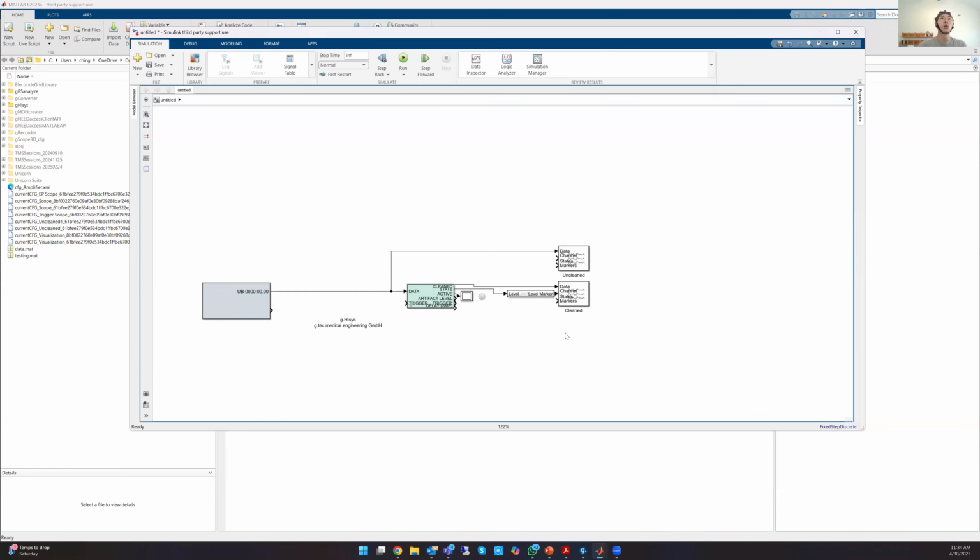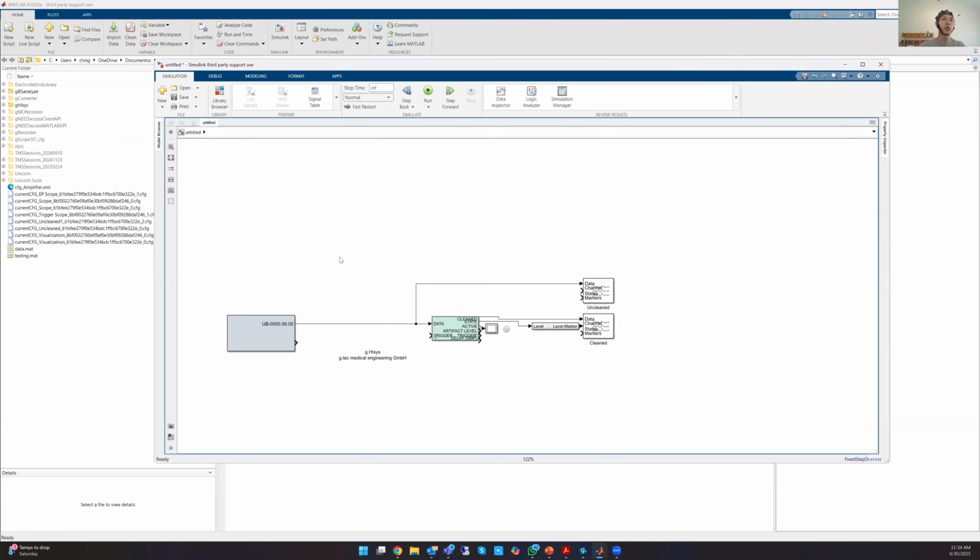Okay. So it seems to be set up already. Let's go back to the software. This is the data acquisition toolbox. We're connecting with the device. I double click on it. It will automatically search for a device on the server. So here you go.